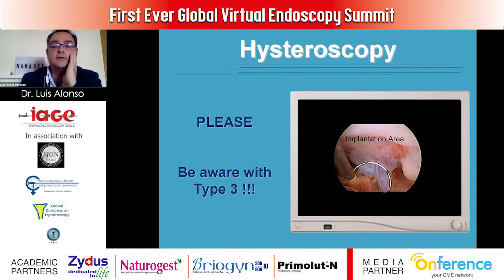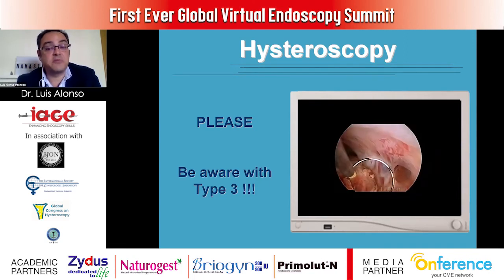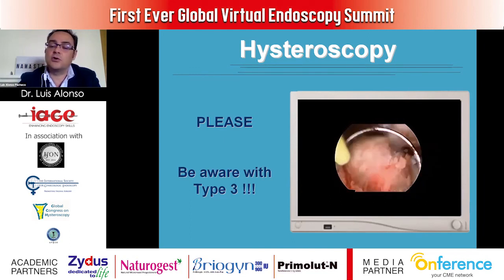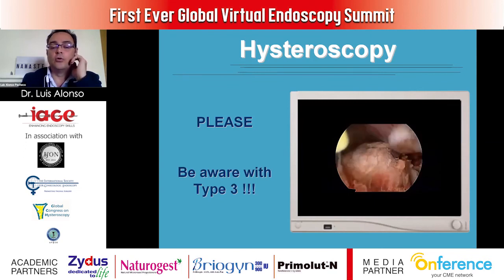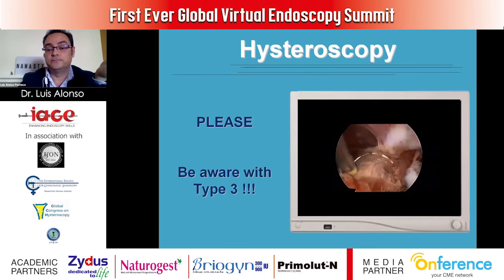I have only 2 minutes, so selective coagulation of the vascular structures. Now here we're talking about type 3. Okay, and we have to coagulate the area and remove the tissue, because sometimes we have big bleeding. We can use the coagulation with the loop or with the ball. And then by pushing, we remove all the tissue.